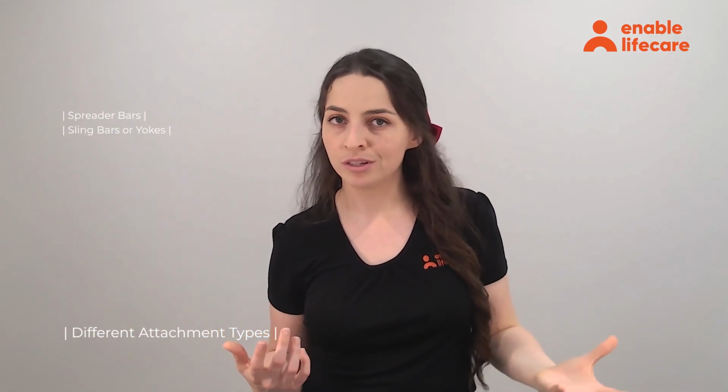Now let's talk about the different attachment types, your spreader bars, sling bars or yokes, and pivot frames, because they go hand in hand with your slings. So firstly, we'll start with a 2-point spreader bar. These are compact and easy to use. So there's only 2 attachment points on a 2-point spreader bar. So very quick and easy to attach those slings. They're going to be great for small spaces and quick transfers, because it's not going to take that long to be able to attach those loops.